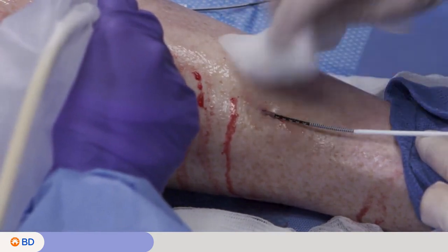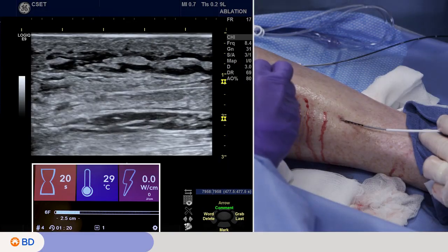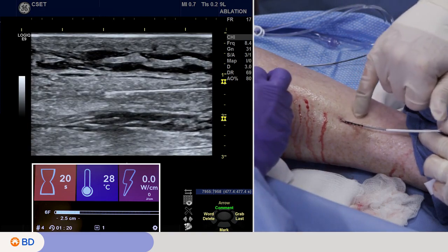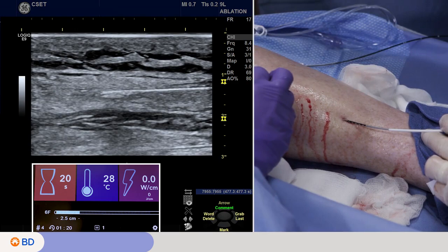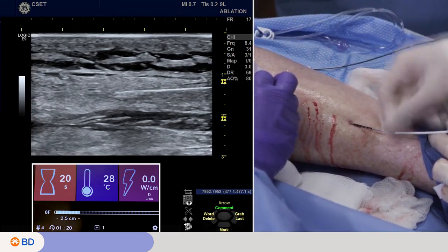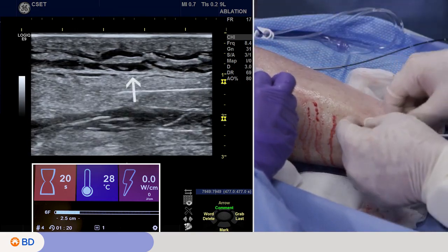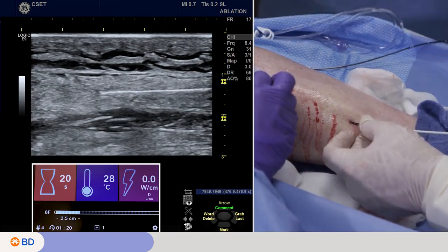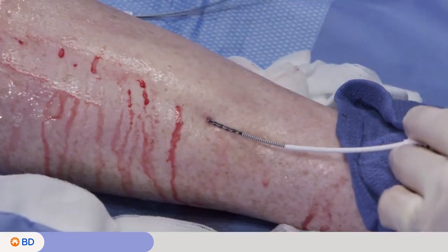Now, as you can see, the coil is outside the skin. It's outside the body. Again, if we were on the 10 and didn't switch, we would be burning a hole at the skin. Not advised. And so we also know that we switched it to 2.5 and we're down a little lower here. And so this is where it's just above that area, the sural nerve, and we want to stay a safety distance away. And so I believe we will stop here, again, to preserve safety for that sural nerve.